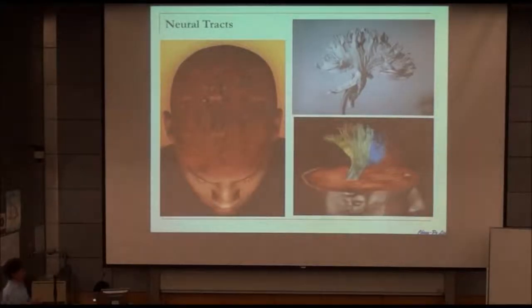And then I will introduce to you the other technique we call diffusion MRI. That is the only method nowadays that can be used to non-invasively detect neuron tracks in the brain. And here is an example, the internal capsule. You can see there is this kind of model from a postmortem brain, and nowadays we can acquire the signal non-invasively in the living brain. So this is a very powerful technique nowadays to detect the neural tracks.